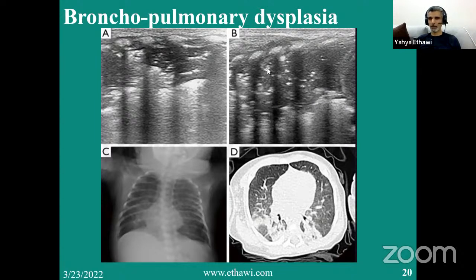So still there are B lines. This is still lung tissue, but it's abnormal. So you can see even the B lines are inside the lesions, but they have different contrast here. That means there is a little bit of fibrosis here. There is more fluid here. There is air bronchogram, losing the pleura. And you can see the B lines are starting haphazardly in different planes.